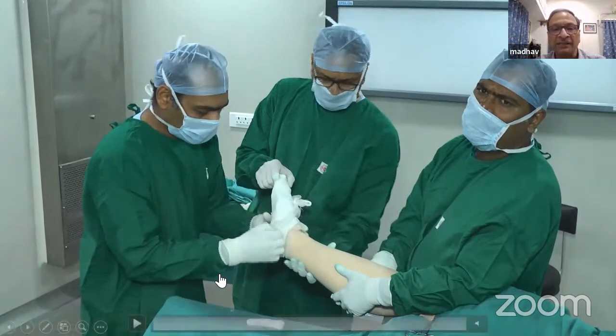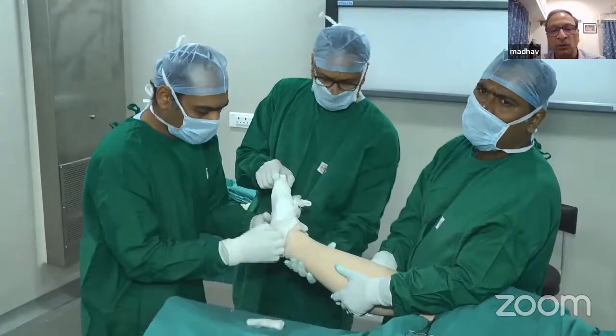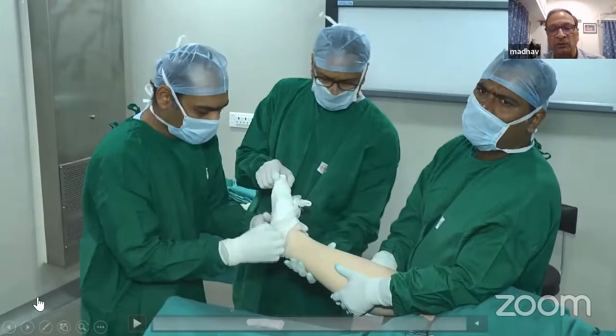So now you can see that the lower extremity from ankle up to the knee joint is exposed. If that is the area that you are operating on, you have a completely isolated area. The rest of the field is completely covered by your sterile drapes, and this will avoid contamination.